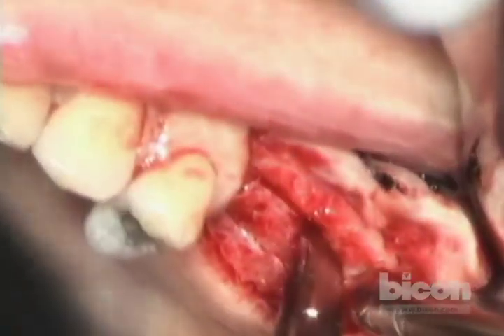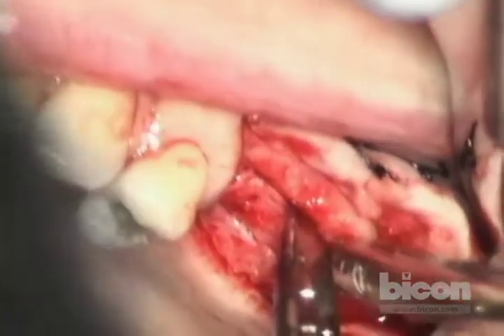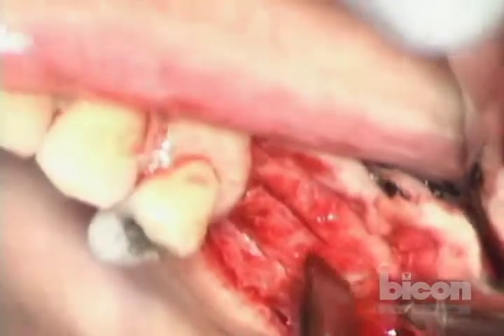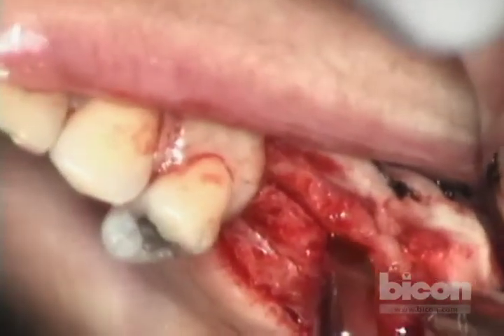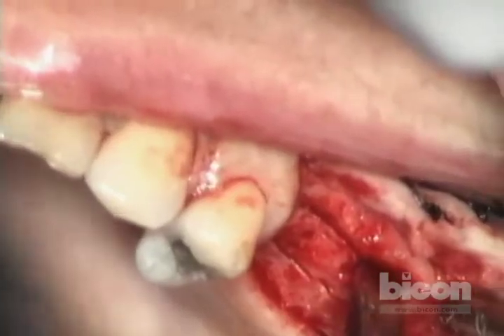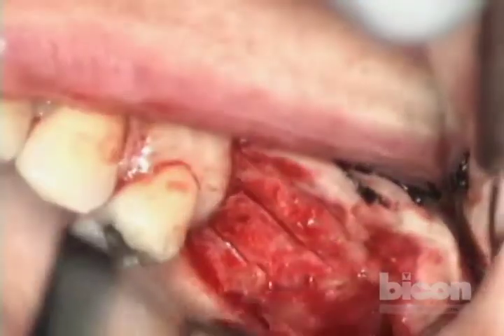The bone in the mesial area is softer because this is an area that had a recent extraction, so the healing isn't complete. Our circulating assistant Kerry is bracing the facial skeleton — basically at the nose bridge, at the frontonasal suture.